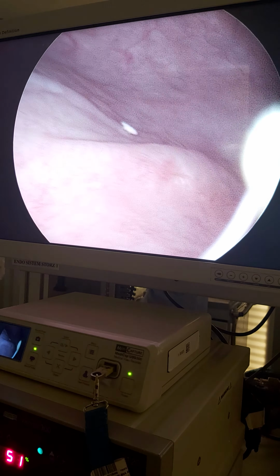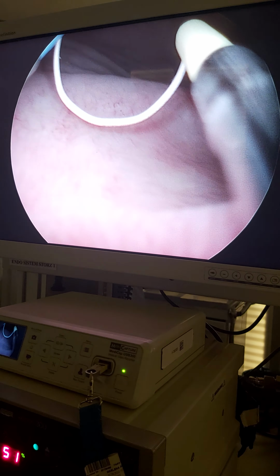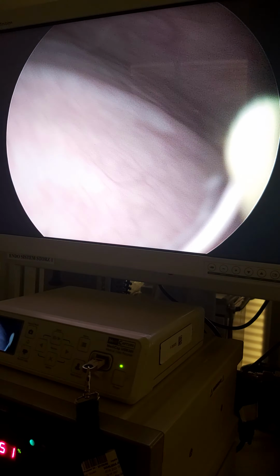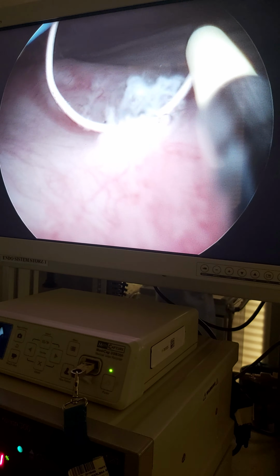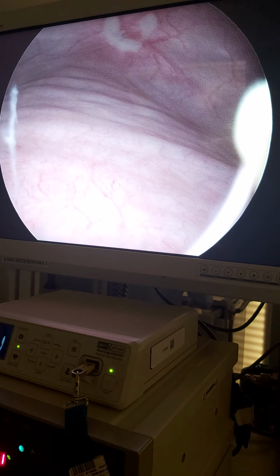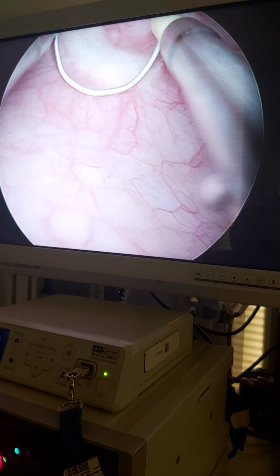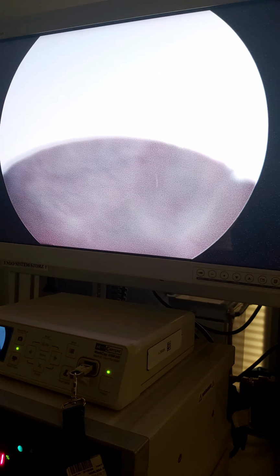Okay, now the better urine is coming out from the kidney. And here I will come until here in the left side. This is the right orifice here. And here there is a border. But behind it, yeah, a little inflammation. Maybe I will make some spots here. Look at this part. Okay. And the upper part of the urethra.